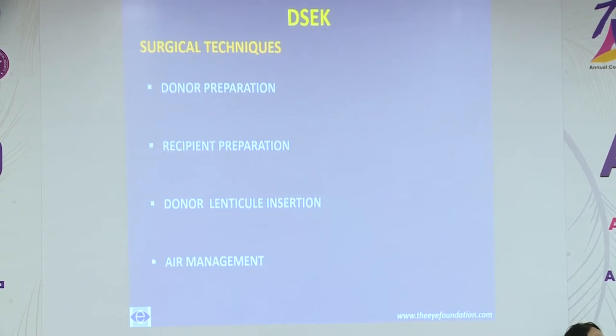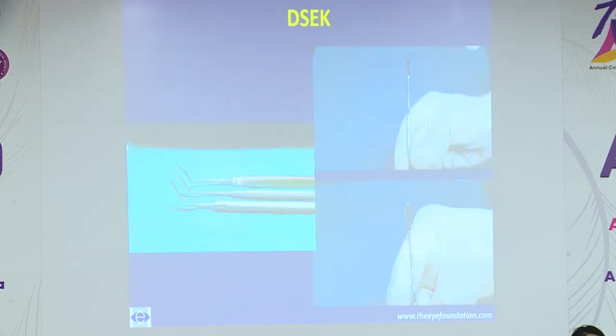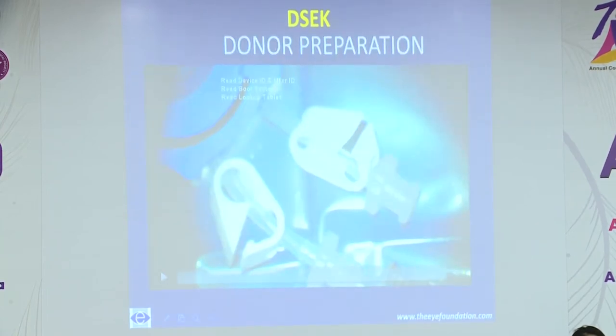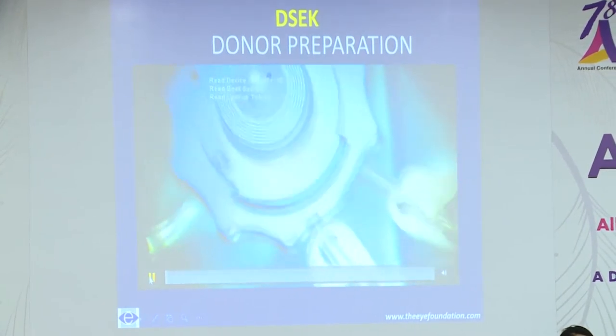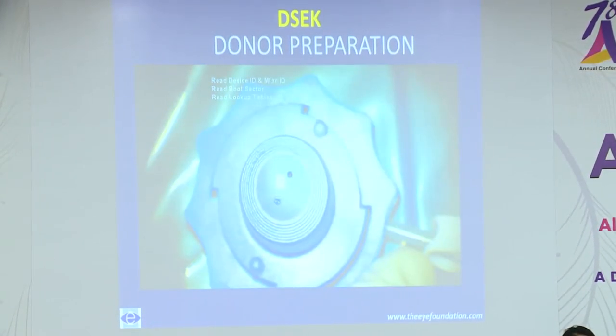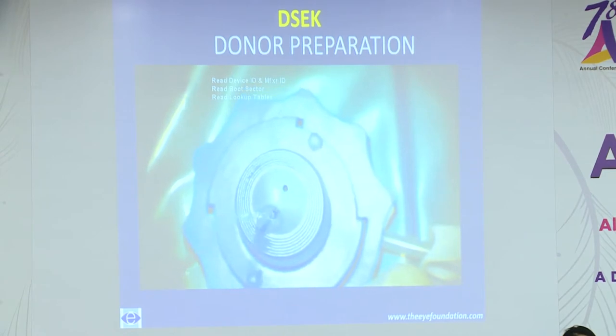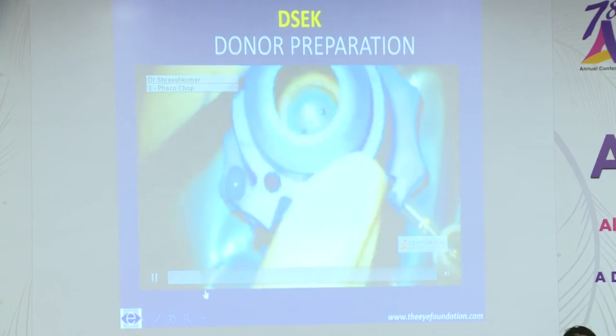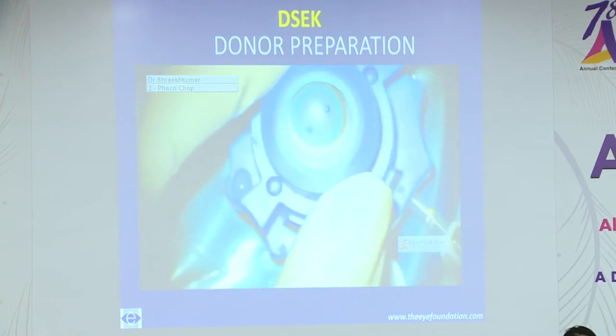So the surgical technique includes donor preparation, recipient preparation, donor lenticule insertion, and air bubble management to oppose the graft in situ. These are some of the instruments which we commonly use for a DSEK procedure. And the surgical procedure: a disposable artificial anterior chamber, like the Coronet instruments. We can of course use it for 7 to 8 cases without any problem.